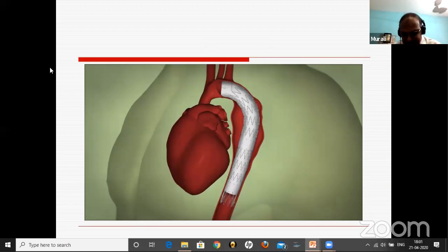Okay. In aortic dissection, the most important thing is the entry point. If you cover the entry point, you would have sorted out most of the issues in acute dissections. Still, if you see some of these branches are getting obstructed, then you come down, try to cannulate the graft and put additional bare stents or a stent graft into those branches which are getting obstructed. But what we have seen is, we can show some examples also. It's not in this presentation. The moment you close the top, all the other things will open out, especially in the acute stage.